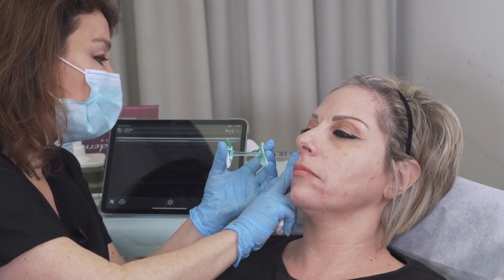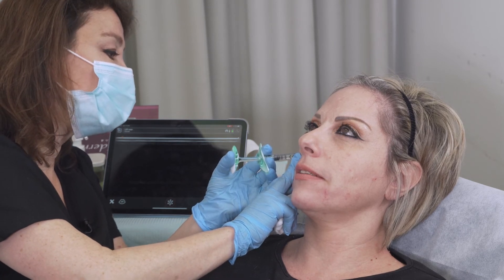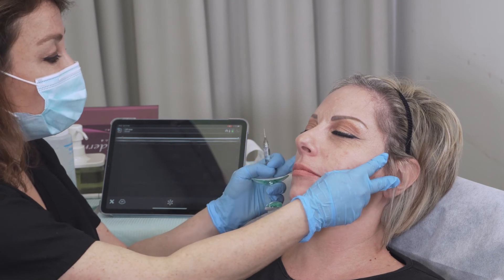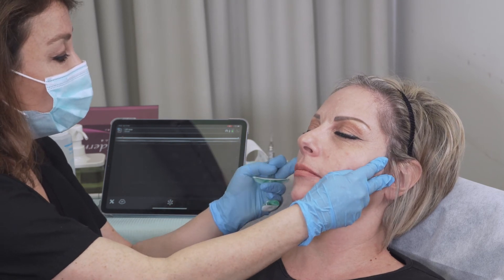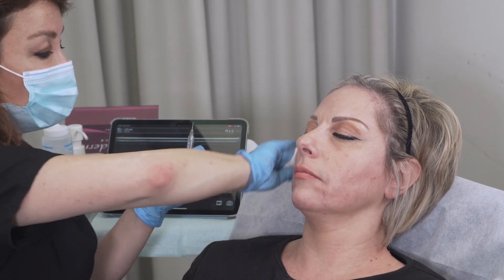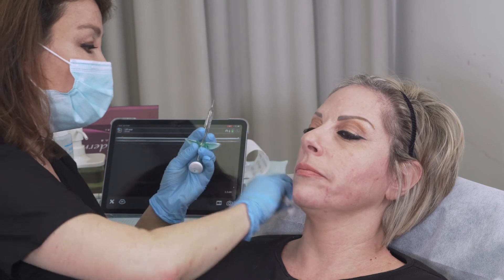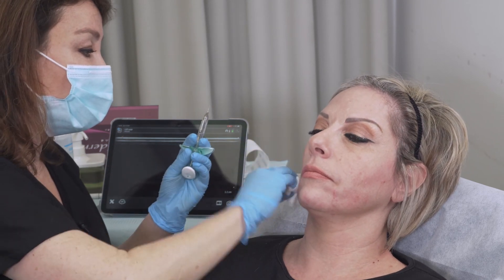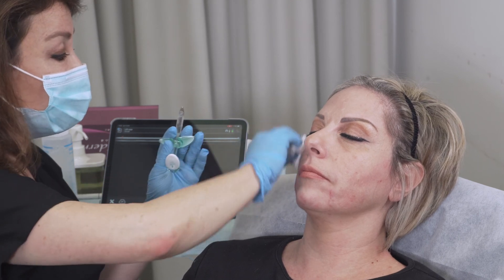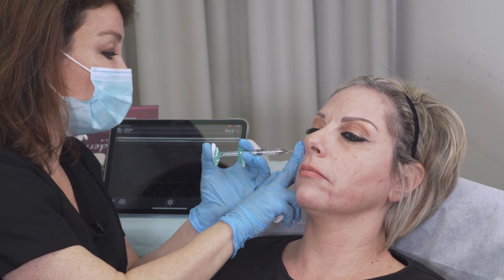Here I'm injecting on the bone — deep on the zygomatic bone — and that will give us a very nice result. I'm well away from the vessels in this area, because the vessels are more medial.